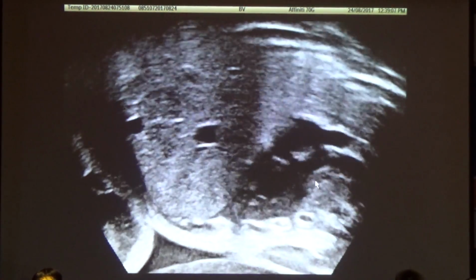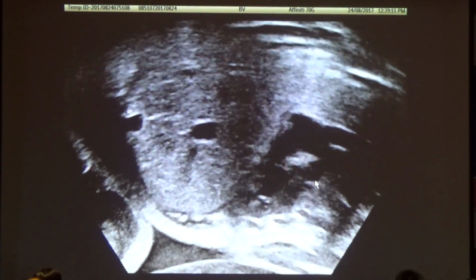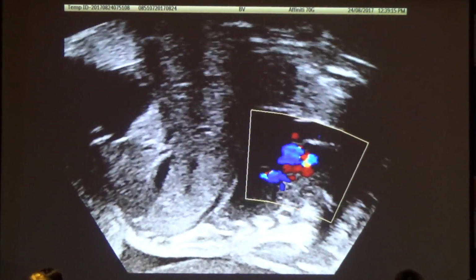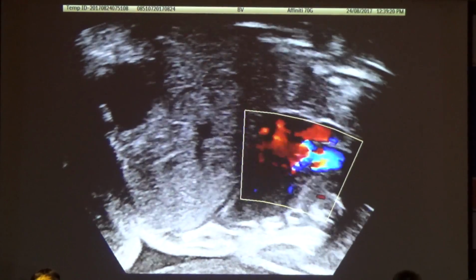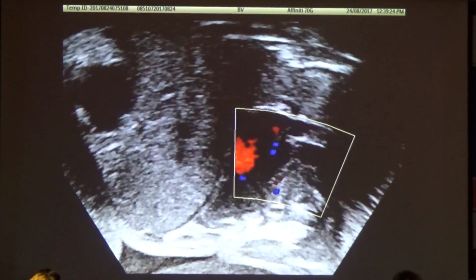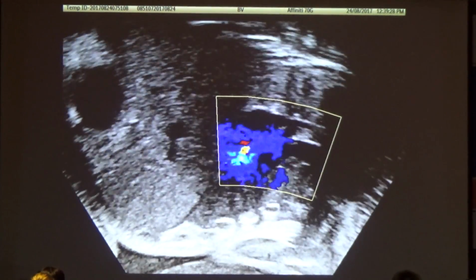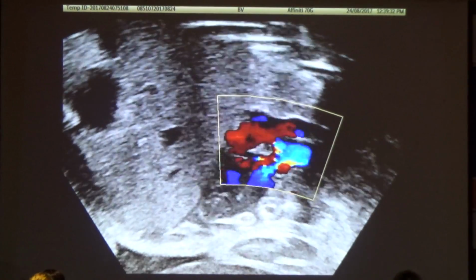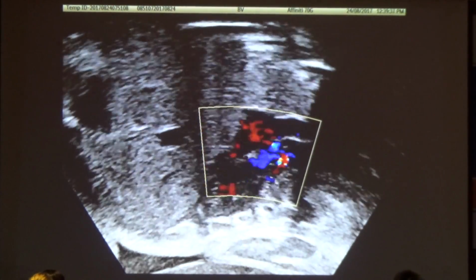At the other great artery, that's that there. Let's just do that there. Bless you. That's SVC and great vessel. That's obviously the other great vessel. And that must be the right ventricle. So SVC to tricuspid valve. It looks like there may be a little whiff of tricuspid regurg there.